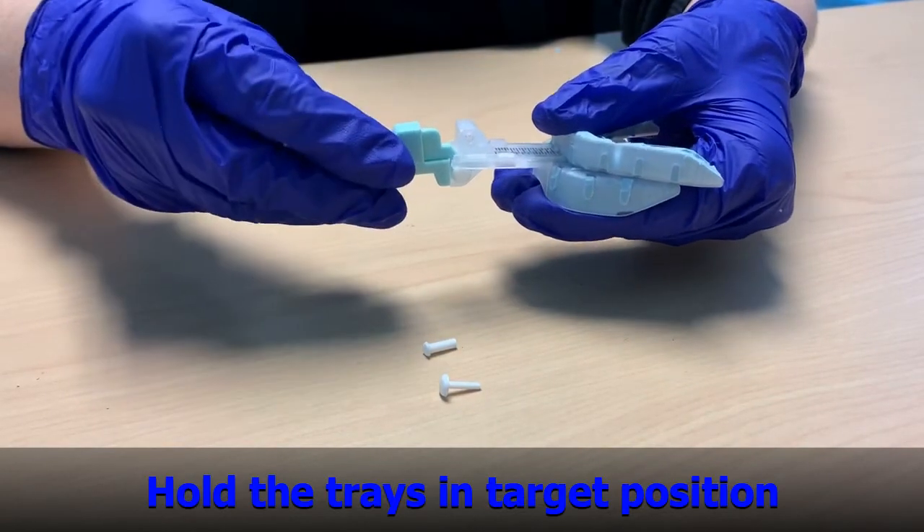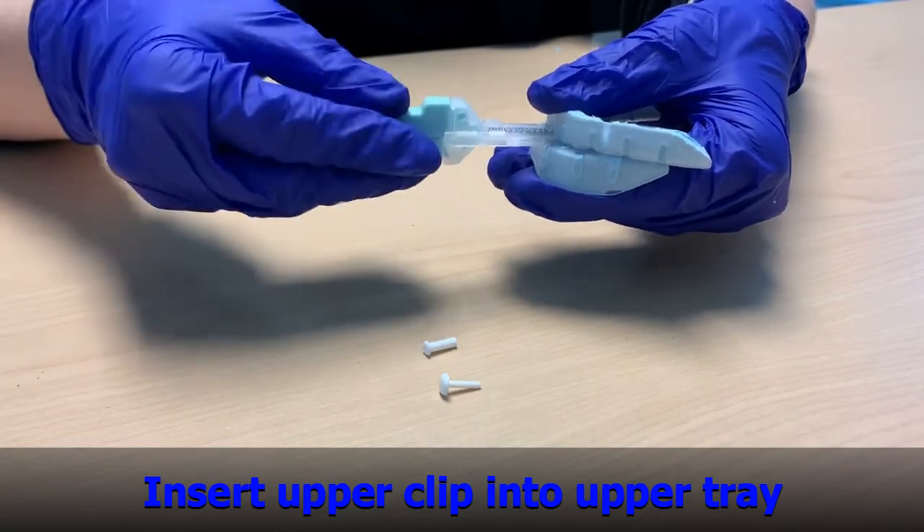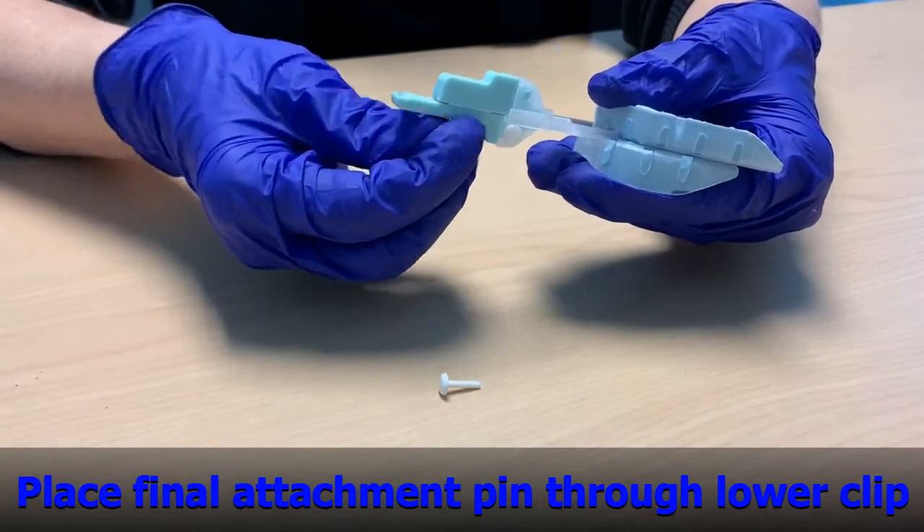Step 6. Insert the upper clip into the upper tray. Step 7. Place the final attachment pin through the lower clip.